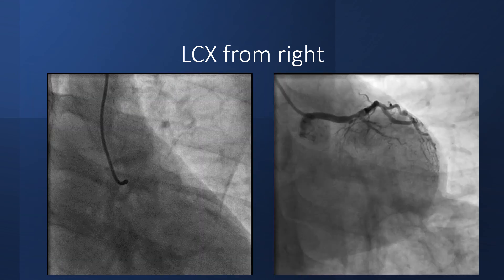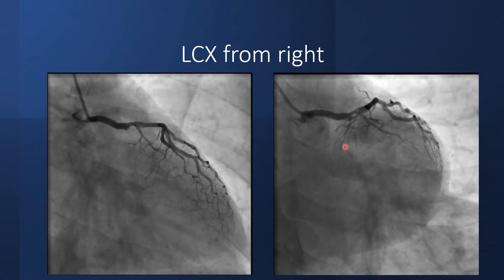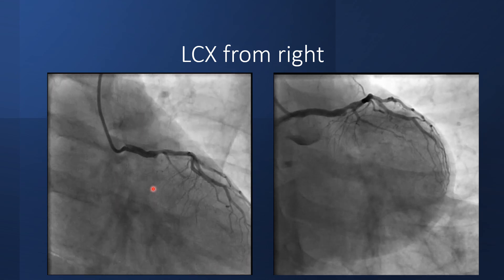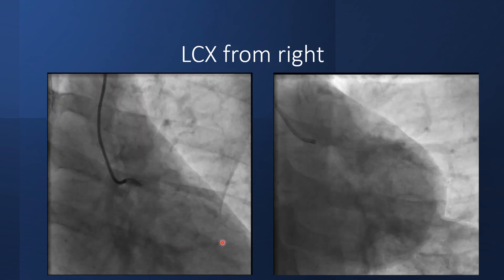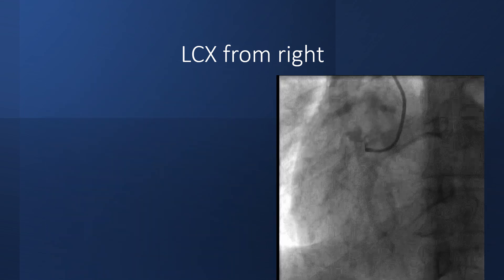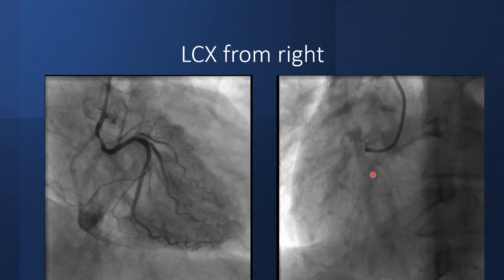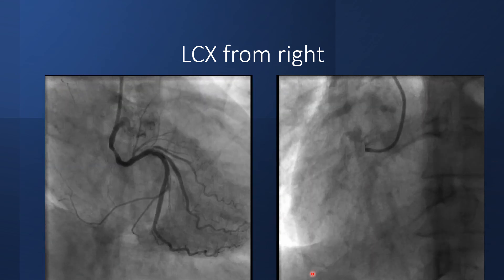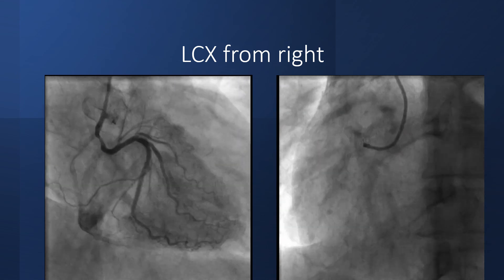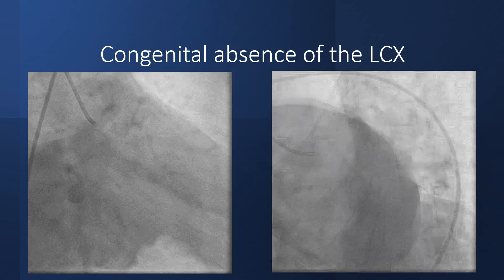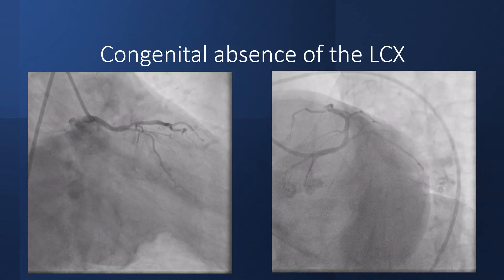In this case, the circumflex looks to be totally occluded. The patient had atherosclerosis and there is some stump and the area supplied by the circumflex is empty. But engagement of the RCA showed the circumflex arising anomalously from the right sinus of Valsalva with a critical lesion at its proximal part. This is a case of congenital absence of the left circumflex.